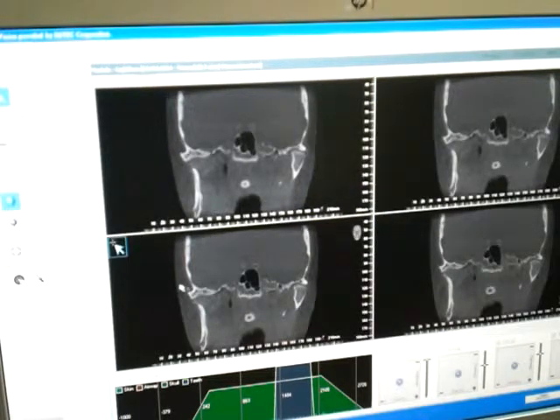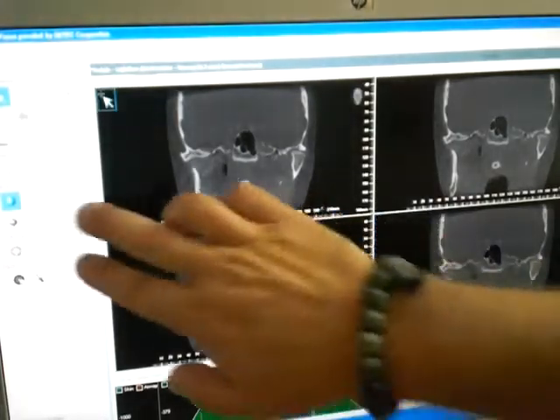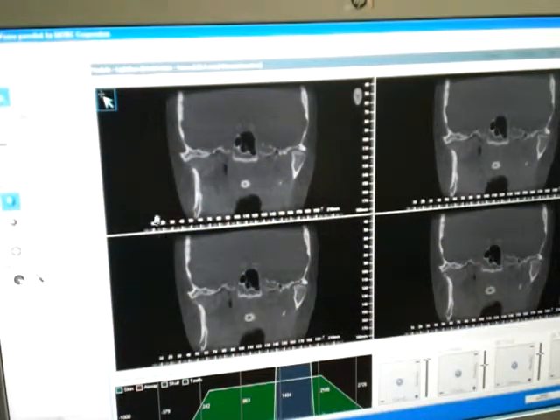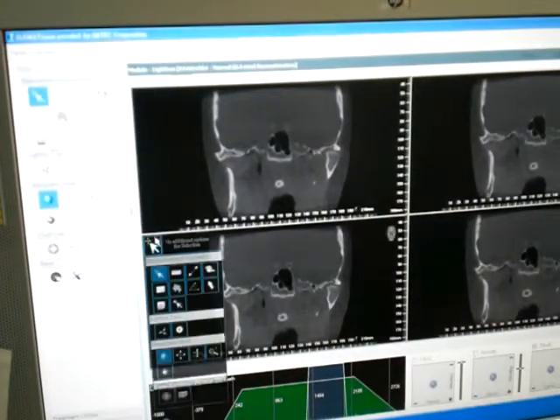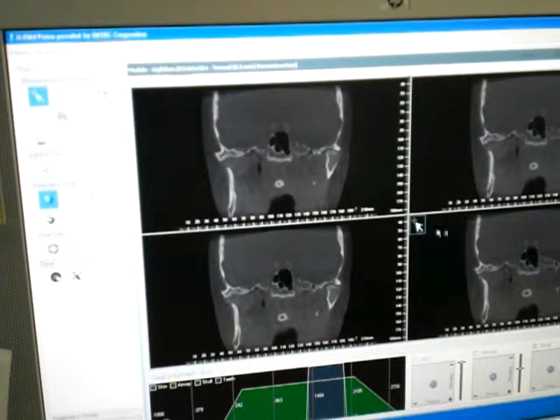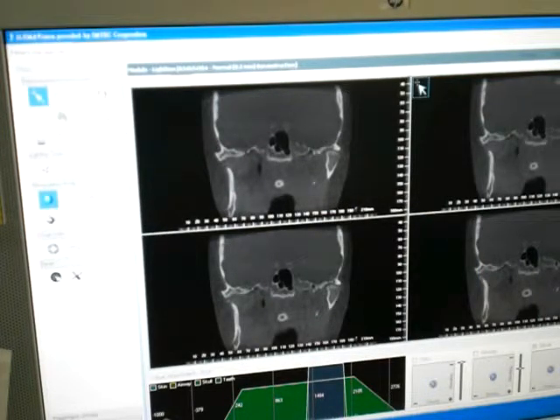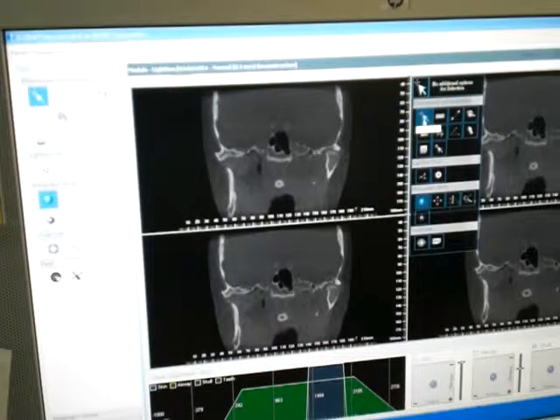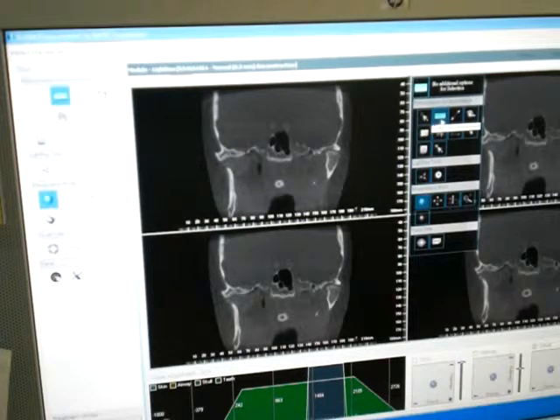If you put the arrow over here, it gives you all the same functions that are also on the left-hand side. Let's go over some of those functions — this one is just navigation, and this one is to measure.